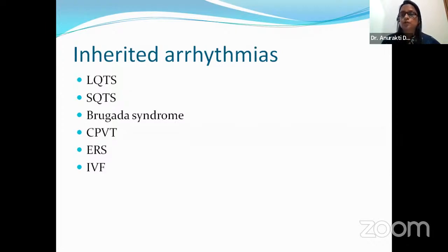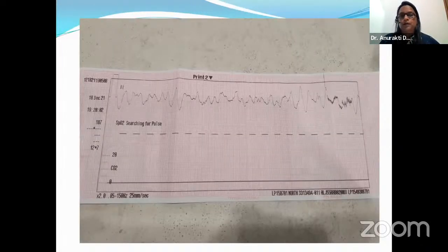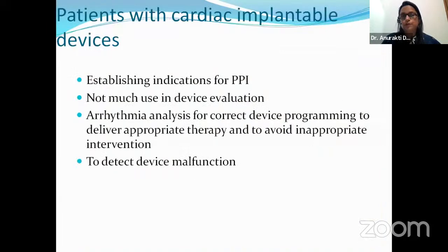Even in CPVT, if you are giving a drug, you have to see the effect of the drug on Holter monitoring. This is one of the patients of long QT syndrome, who after getting up, hearing the alarm, had this episode and came to our office. This is the patient I was talking to you about, who had an arrest and was finally found to be CPVT.